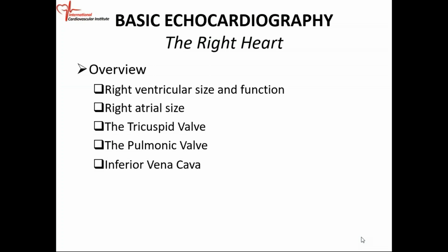Okay. So in reviewing the right heart, we're going to look at the right ventricle. Of course, we're going to look at the size and the function, how to assess the size of the right ventricle, how to assess the function of the right ventricle. We're also going to look at the right atrial size, how to measure the size of the right atrium.